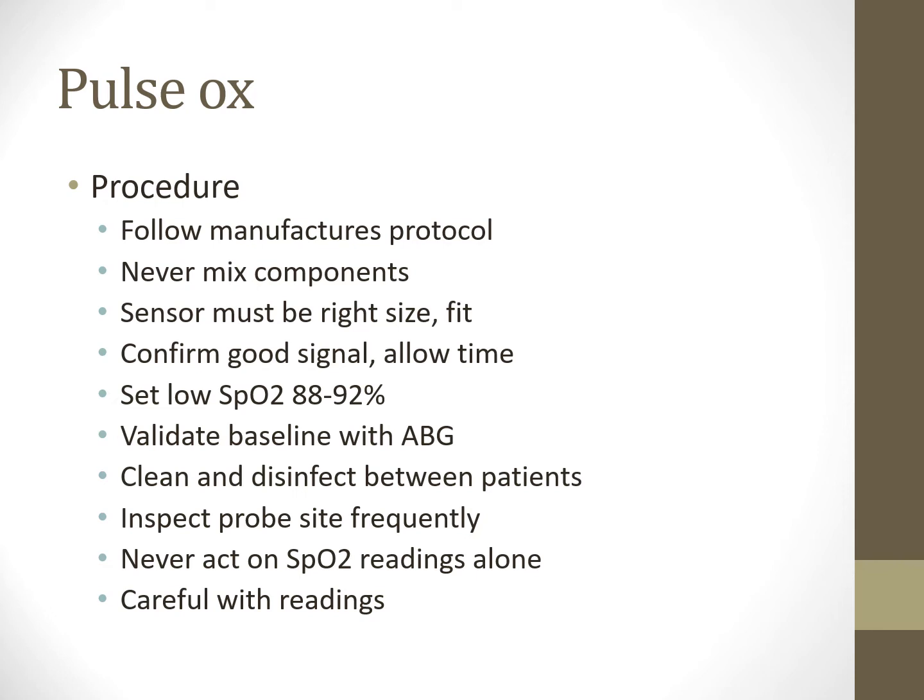machine. Sensor should be the right size. You're usually not going to use a neonate sensor that's supposed to go on a neonate's finger or toe or heel. You're not going to use that on the adult finger. It's not going to be nearly as accurate there. So make sure you're using the right sensor size. And they have all different sizes.